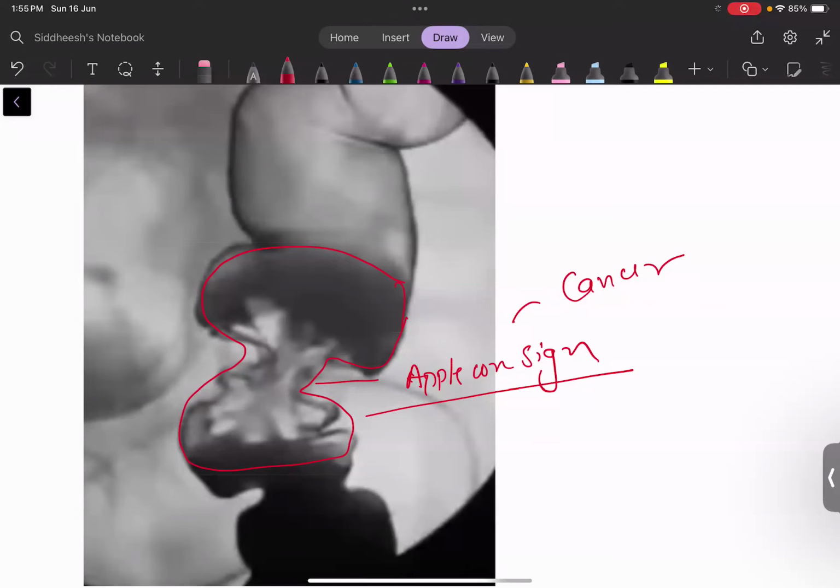But the intestine is long and a lot of air will be there. So the biggest enemy of ultrasound is what? Air. Remember the simple principle. That's why we put gel before doing the ultrasound. Why? Because air is the biggest enemy. So that is why we should not perform ultrasound for the intestine. Nowadays, we are practicing high definition, high ultrasonic probes for the diagnosis of IBD, but we are not doing it at every center. So remember this part, okay?